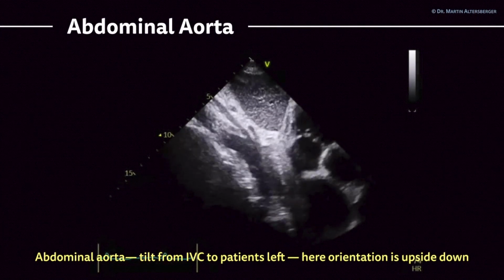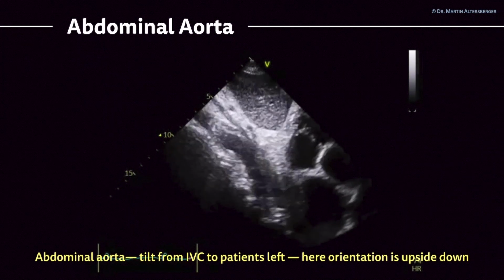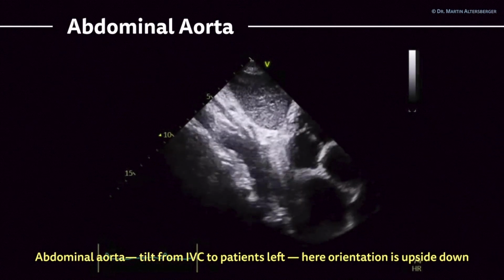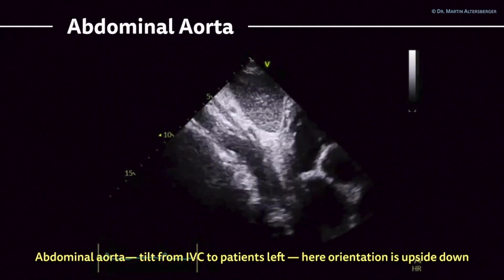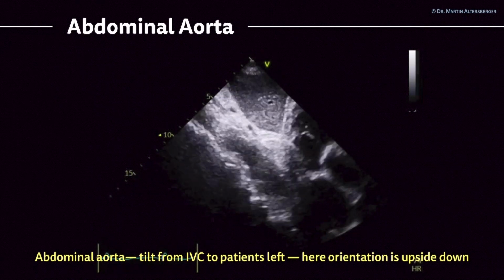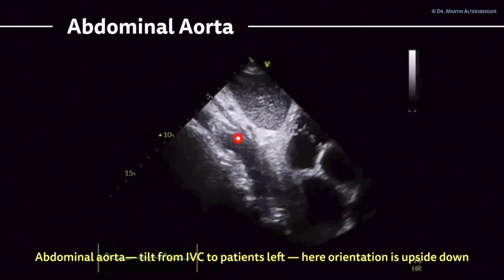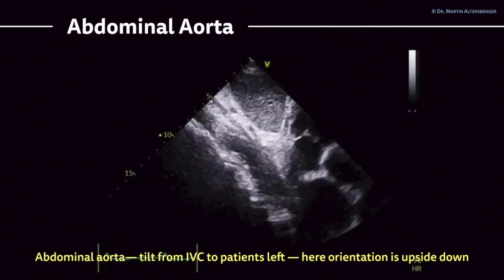Continuing from the IVC, we can also scan the aorta. Sometimes you still have to rotate a little bit. For the aorta, you simply have to have the IVC in the optimal longitudinal plane and then tilt the transducer more to the left side of the patient, where you would expect, of course, the aorta. Here you have the aorta seen in this image. It's normal in size. You have the celiac trunk, the superior mesenteric artery, here the liver, the right atrium seen as well.